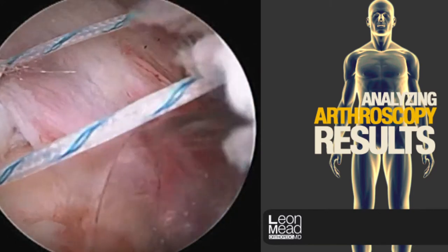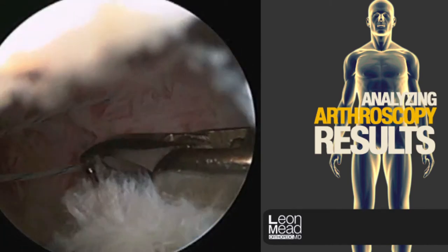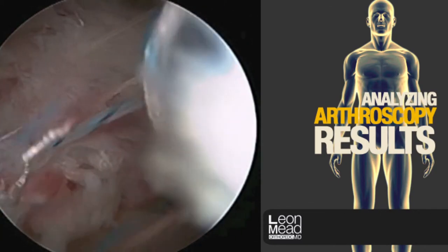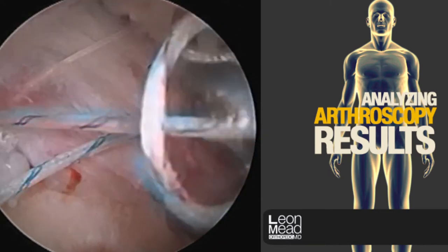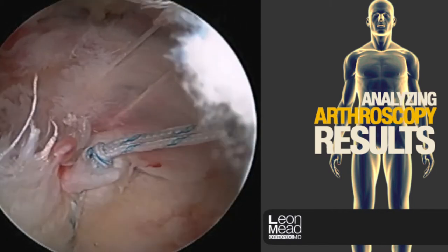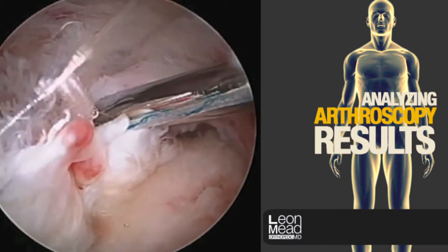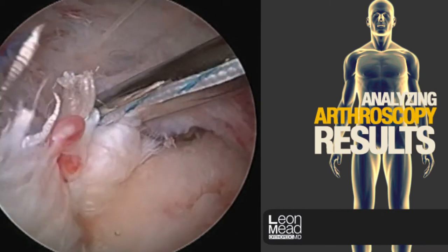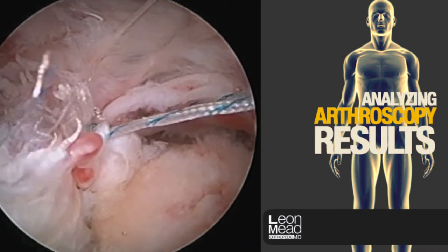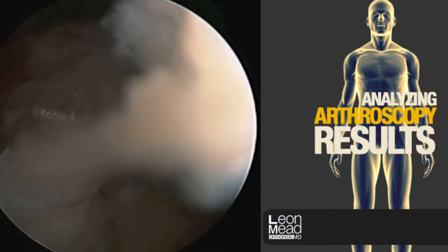Now we are going to tie the sutures, starting on the outer edge first. We'll grasp two limbs of each suture — they all start to look alike, so it's important that we grab the appropriate one. The sutures are tied outside of the body using a self-locking sliding knot. The six-finger knot tyer will help secure it fully and hold it in place while a second suture limb is tied to lock it. We then tie a series of arthroscopic square knots to augment this, and cut the suture.